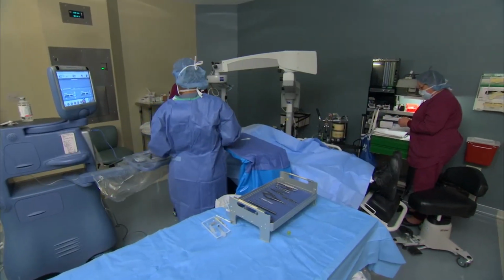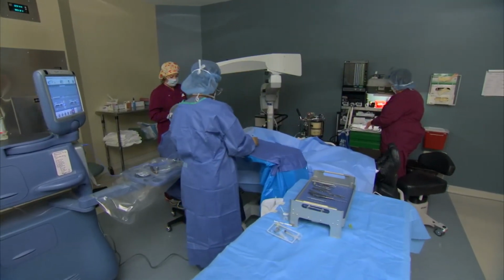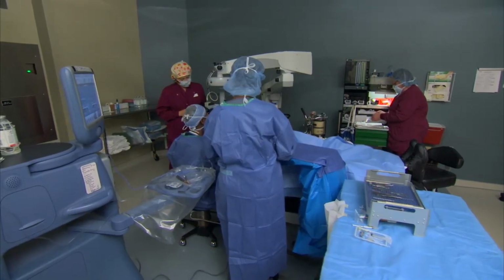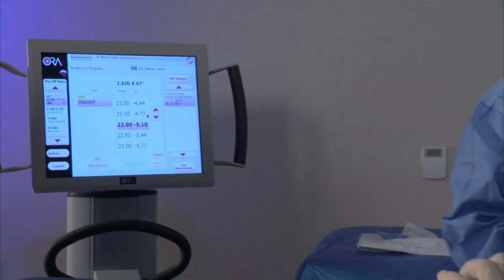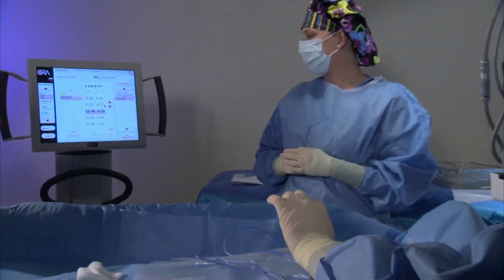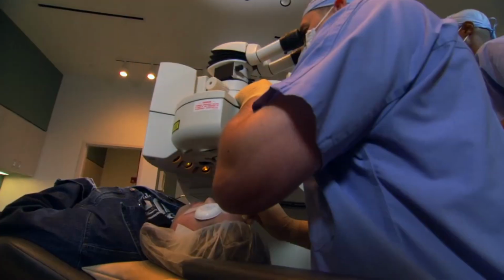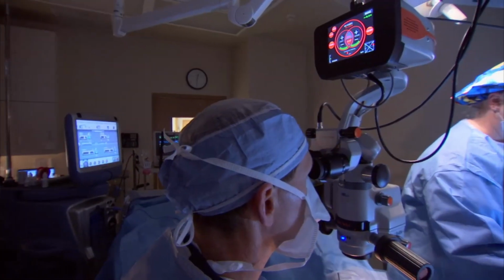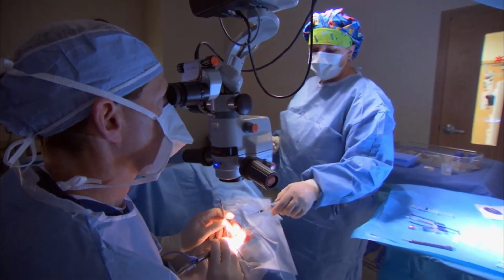You should understand that it is possible that your surgeon may encounter a condition or complication during surgery that would prevent you from having the type of lens implant that you chose prior to the procedure. It is also possible that the estimated power of the implant selected could be too strong or too weak. This would result in the need for you to wear glasses or have laser vision correction to fine-tune your vision. It might also require that your lens implant be surgically removed and replaced with another implant.